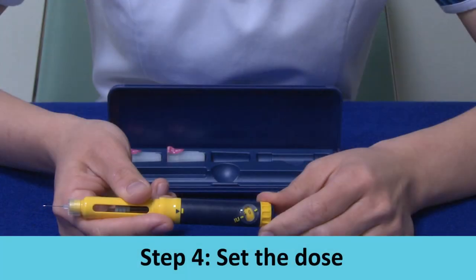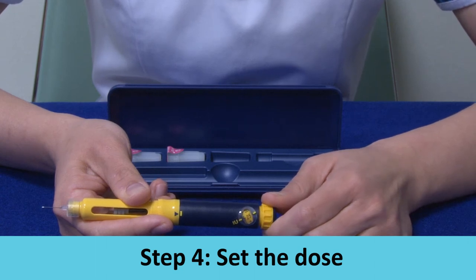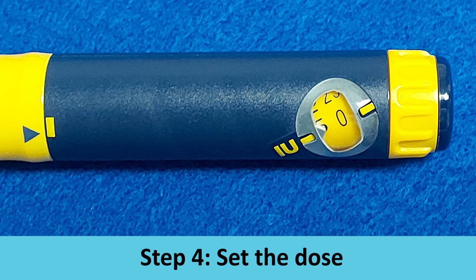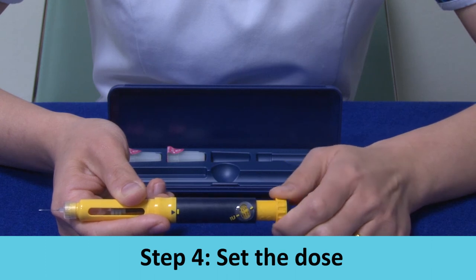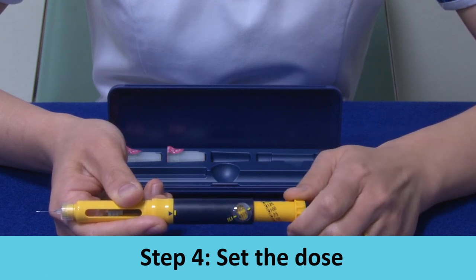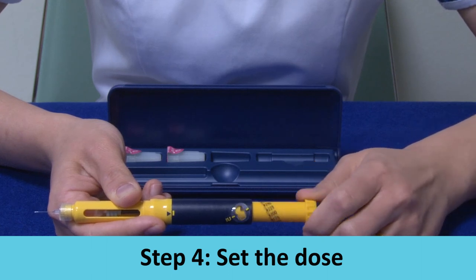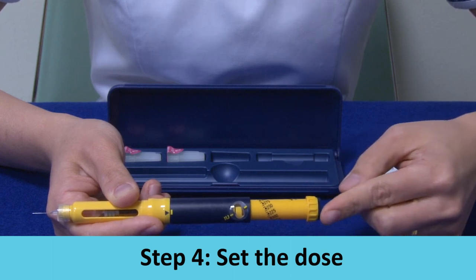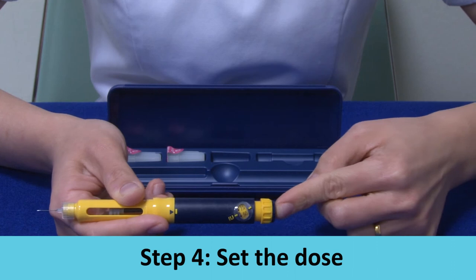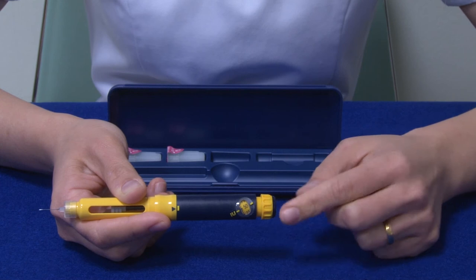Step 4: Set the dose. Turn the knob anti-clockwise to the prescribed dose. If by accident you turn the dosage knob past the prescribed dose, do not try to turn the dosage knob backwards. Continue to turn the dosage knob till the end, past 450 units. Then push the injection button in all the way to zero and redial to the correct dosage.